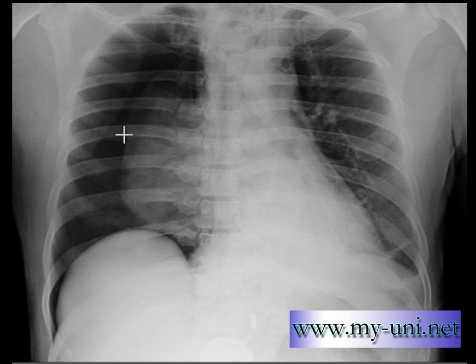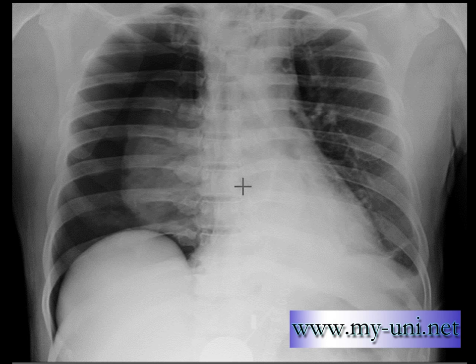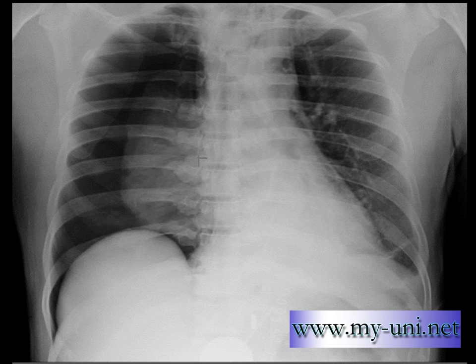The right heart border is not visible only because the lung is collapsed. There is no air within the lung — the air is leaking out of the lung — and because the heart and the collapsed lung have very similar densities, the border of the heart is not visible anymore.